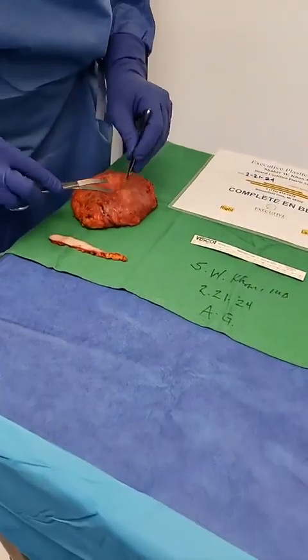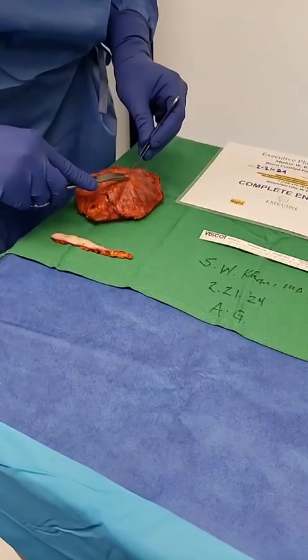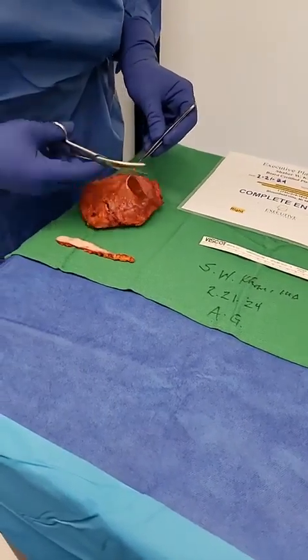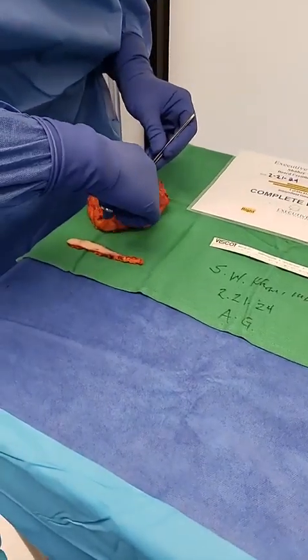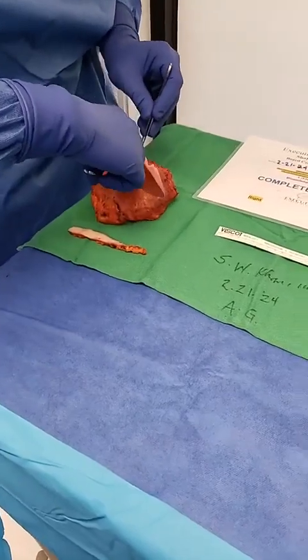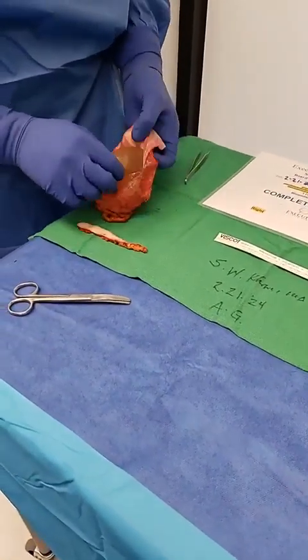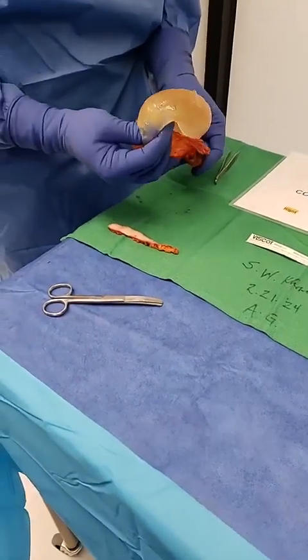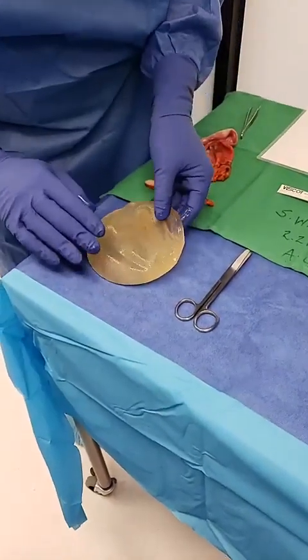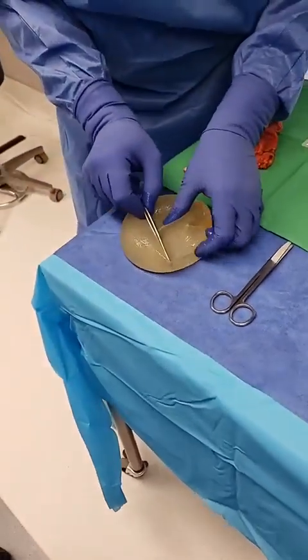She had the many symptoms of breast implant illness. She is a local patient. So as I go in, she has calcification up here, relatively very hard. Now this is your implant, all contained. This is your relatively very wide implant. Now I'm going to go ahead and let's look at this together.